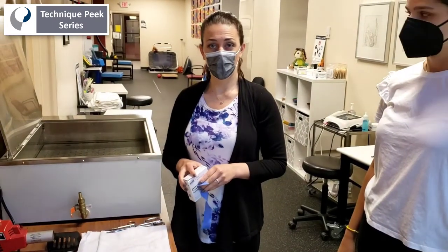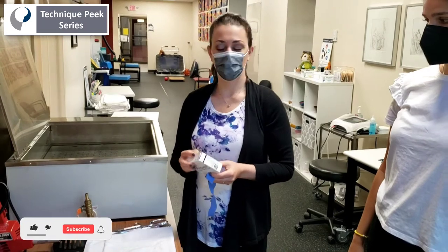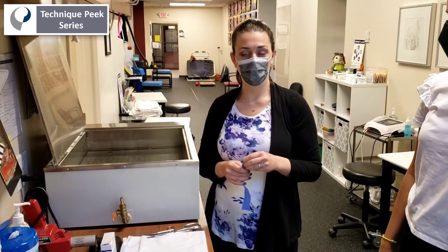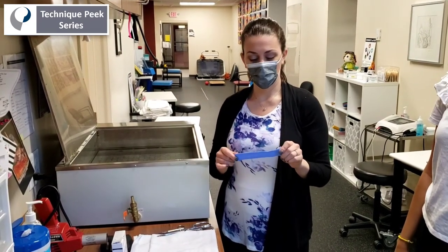I'm going to go over a technique for serial casting using Orphecast. It's a really great and versatile material that we've been using lately. It works best for PIP joint contractures less than 20 degrees. This is a follow-up to one of our previous technique pieces on static progressive PIP joint extension splinting, so once we've used that to achieve a little more PIP joint extension, we can switch to this method.